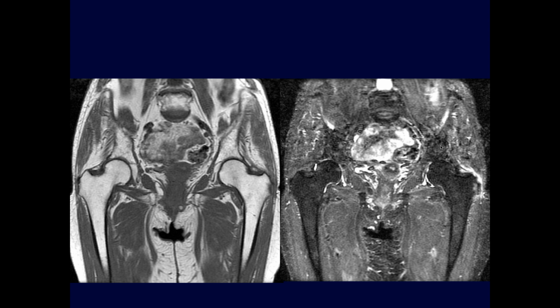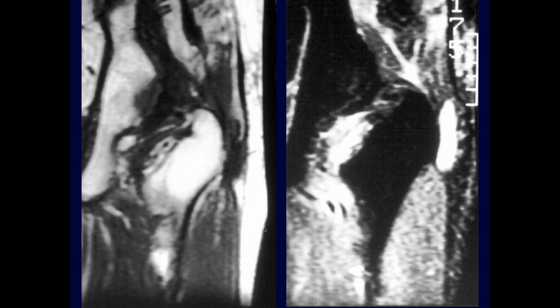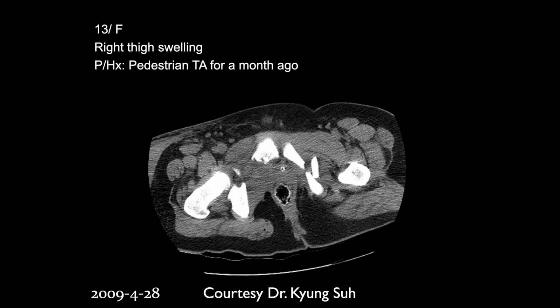All right, so here we have some images through the bilateral greater trochanters, and there's some increased signal and marrow edema along that left greater trochanter, probably near the medius attachment. So this looks like a high grade to complete tear. There's some preferential fatty atrophy of the gluteus medius, and some bursitis. So we call this trochanteric bursitis, as you know, but these are really tears of the tendon insertions there. And this is another really old example of what we used to call trochanteric bursitis, with fluid collecting in the bursa there.